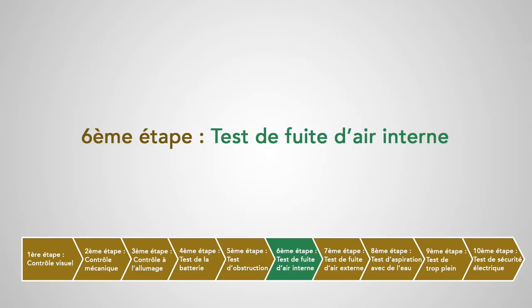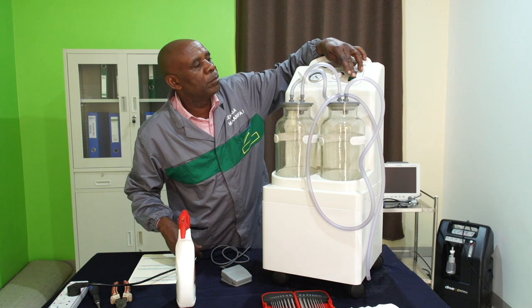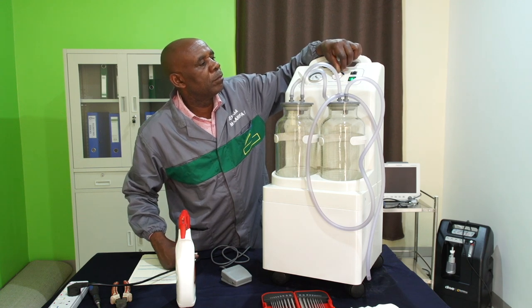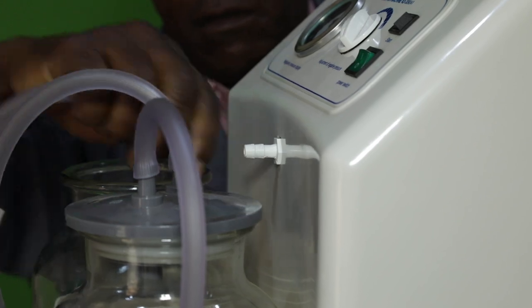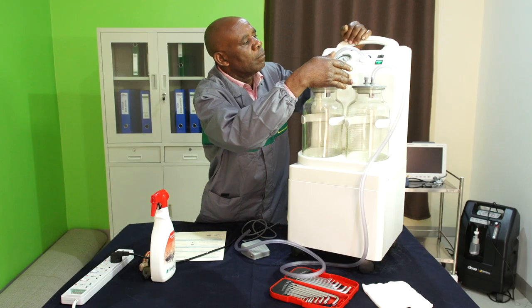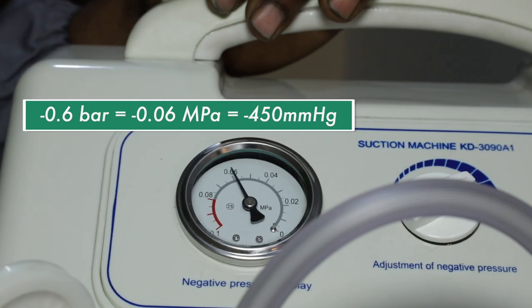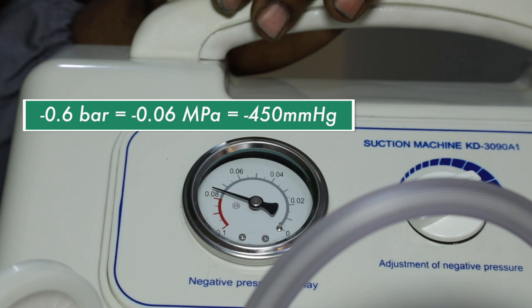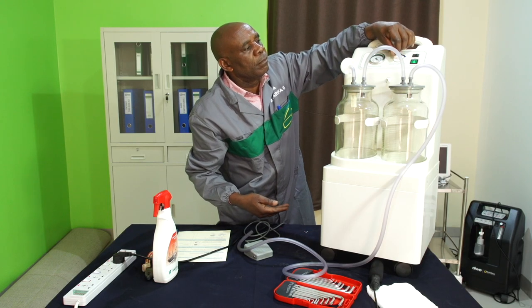Sixième étape : test de fuite d'air interne. On va allumer l'appareil et ajuster le bouton de réglage de l'aspiration au maximum. On va boucher avec les doigts la sortie directe de la pompe, puis vérifier le manomètre. Le vide devrait monter en dessous de -0,6 bar ou -450 mm de mercure. Si ce n'est pas le cas, ceci pourrait indiquer une fuite interne ou une défaillance de la pompe.